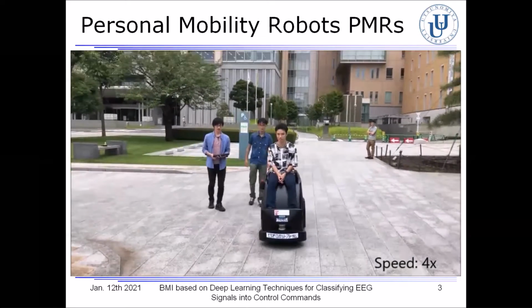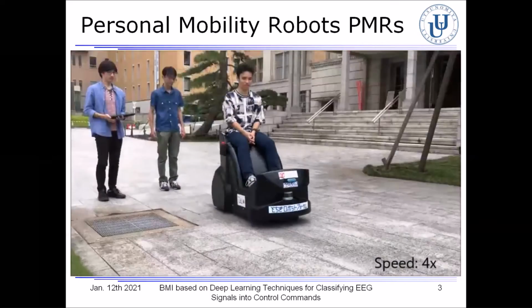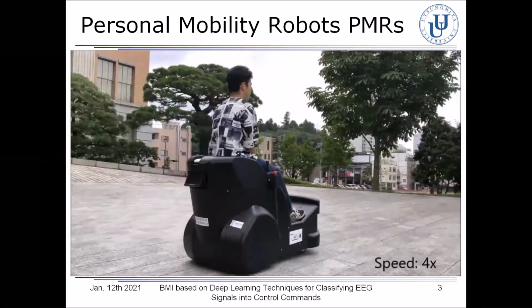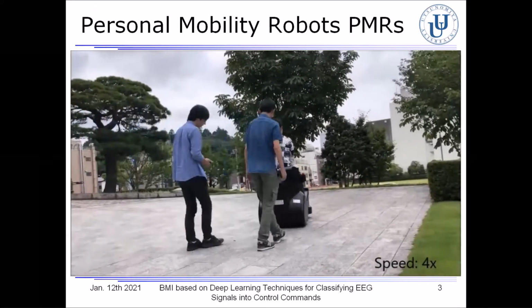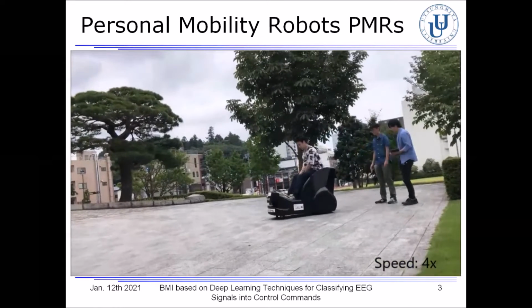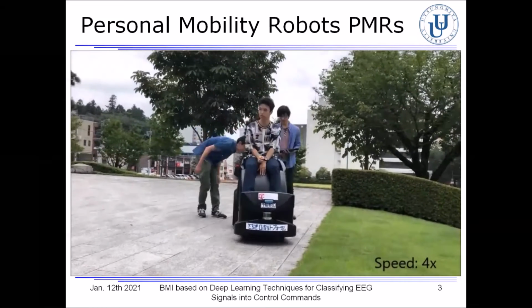Therefore, we focus on EEG signals in the brain. From the EEG-based brain signals, the user's intentions are estimated and interpreted as control commands. This is a so-called brain-machine interface, BMI.